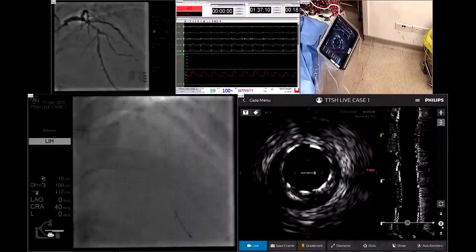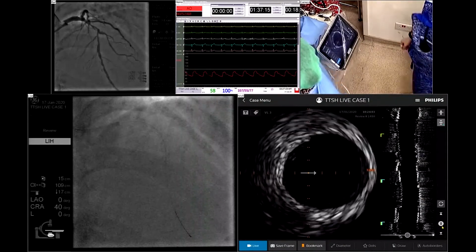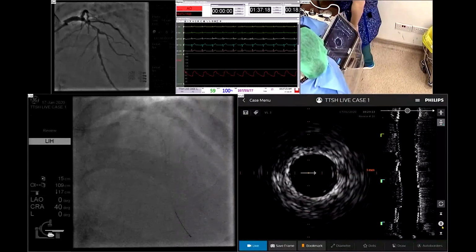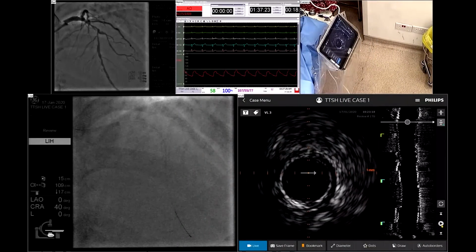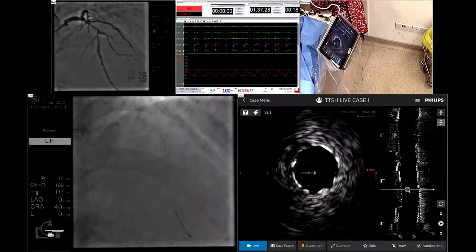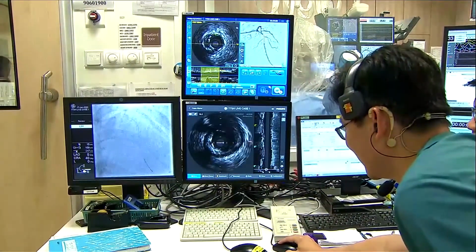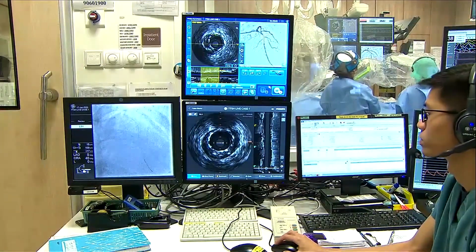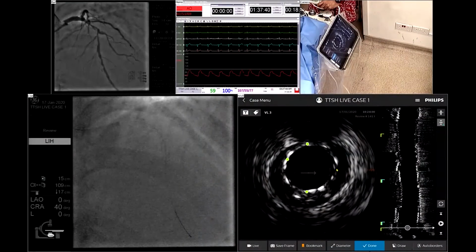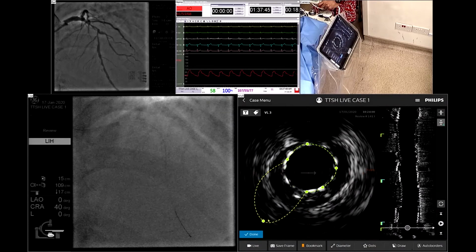Okay, I'm going to play it for you. Here. Okay. Go in a bit. Okay, so we go back in a little bit for me. Okay, well, let me come around, and I think this is the area of interest. You see, this is nice because I can move around here easily. I can be the robot here. You're not very happy here, right? Yes. Okay, can we quick measure that? So my stent is 3.6, 3.8.